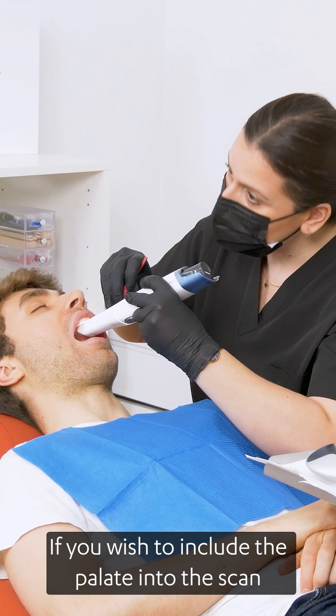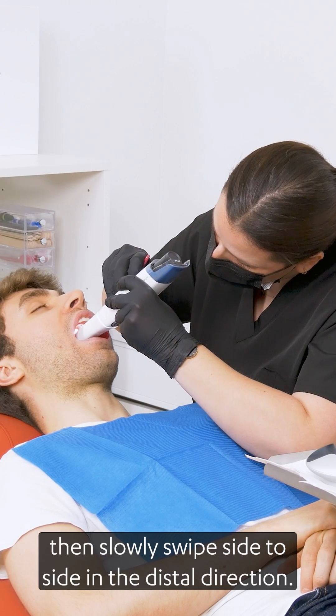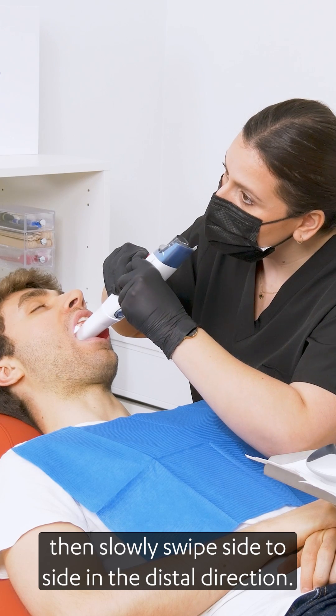If you wish to include the palate into the scan, move the scanner behind the incisors, then slowly swipe side to side in the distal direction.